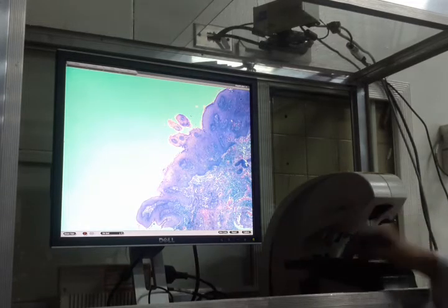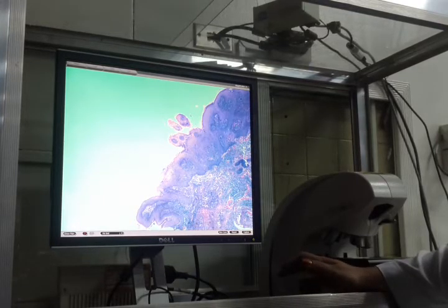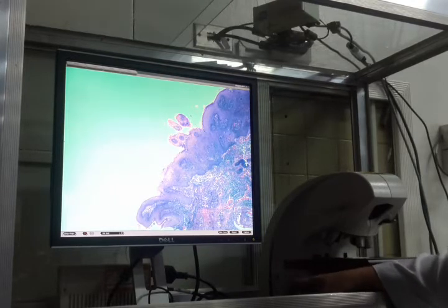Okay? You have acanthosis, papillomatosis, and hyperparakeratosis in this area. This area is lined by a thickened squamous epithelium. This is actually a squamous papilloma. It's a benign condition involving the skin.